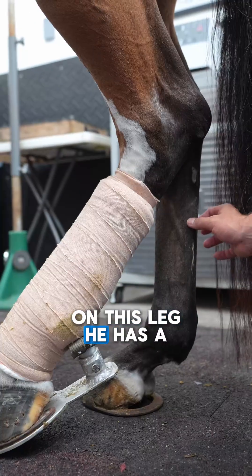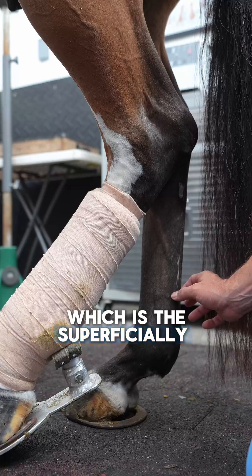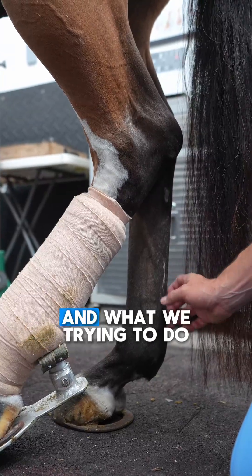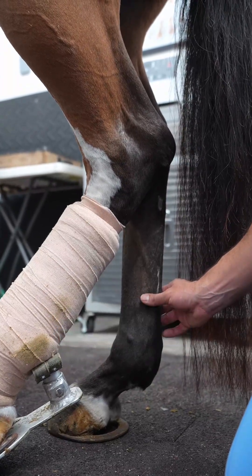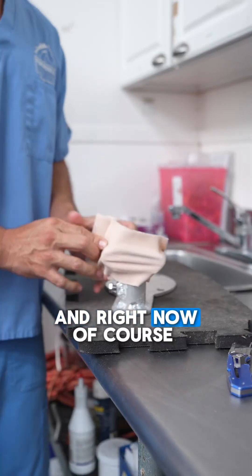On this leg, he has a real bad wound on the superficial digital flexor tendon, and what we're trying to do is give him some extra support.